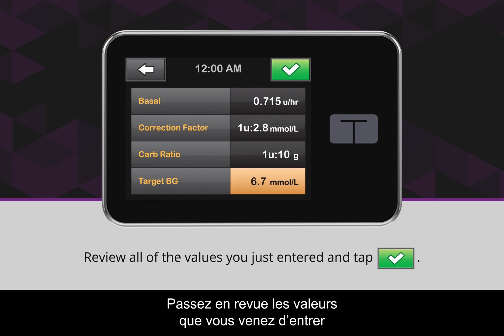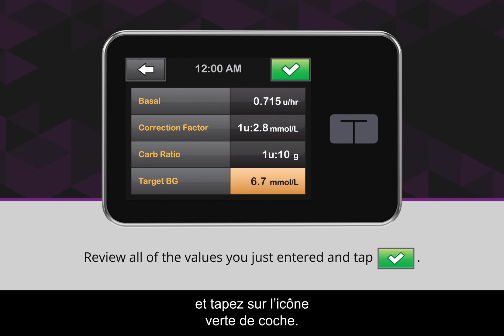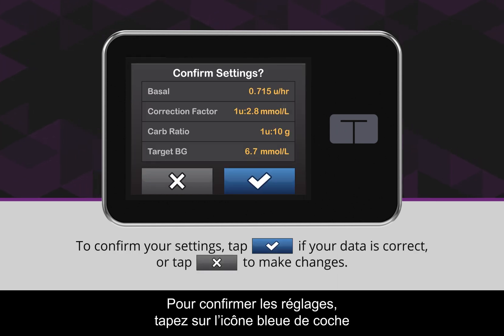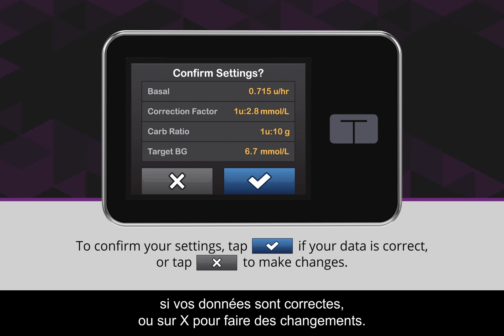Review all of the values you just entered and tap the green checkmark icon. To confirm your settings, tap the blue checkmark icon if your data is correct, or tap the X icon to make changes.